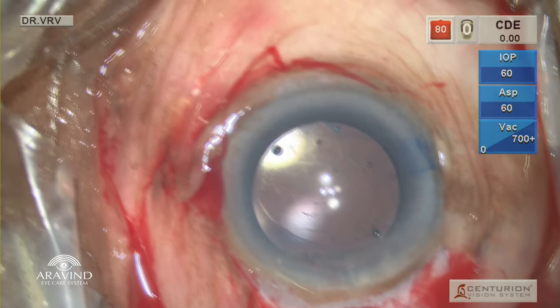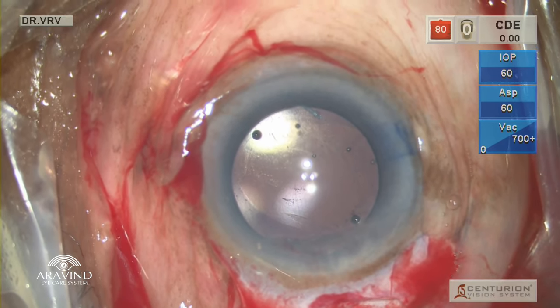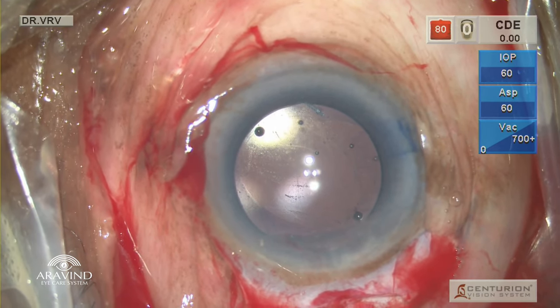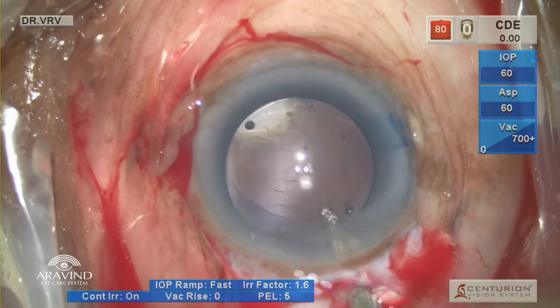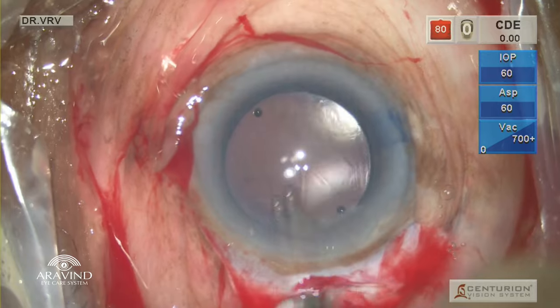So now coming to the next step of visco removal. I do not prefer to aspirate viscoelastic as it takes a lot of time. What I do is I fill the 5cc syringe with BSS connected to the Simcoe cannula. Go in with full flow of the Simcoe cannula.